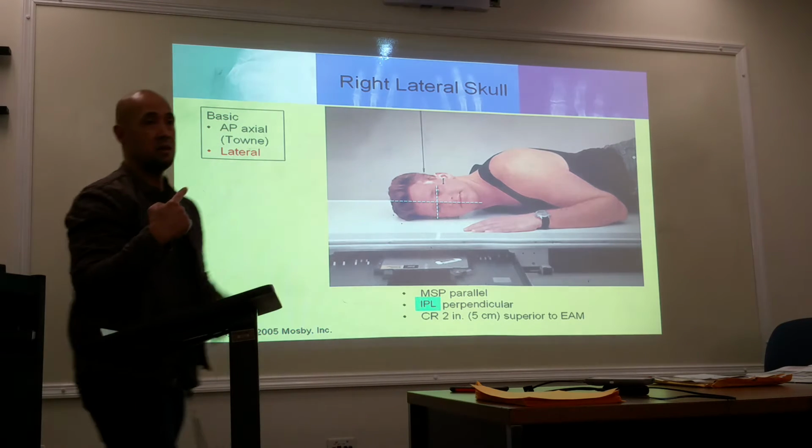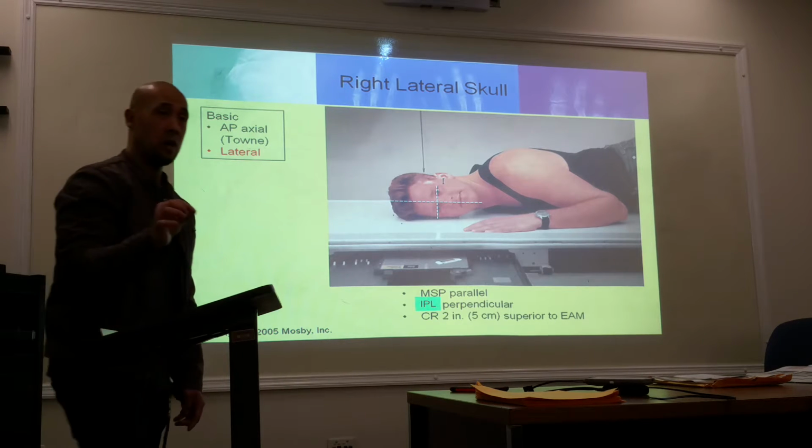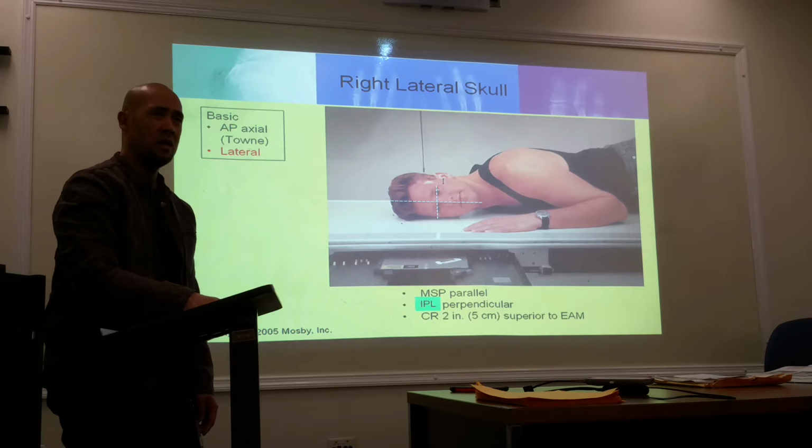Yes. I have seen a mandible and they used a BB to be able to see things. To locate a foreign body? No. Sorry, it was just a regular mandible. No foreign bodies. Do you do that with a regular skull? I've never done BBs on a skull, so I don't know why. I don't understand what the BBs are for. I don't know why, but he taped one onto her face. She got hit in the face with a baseball.